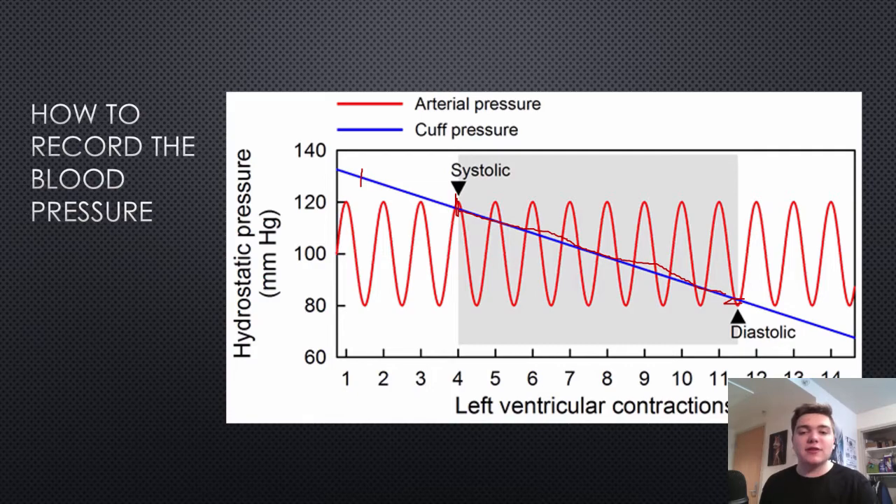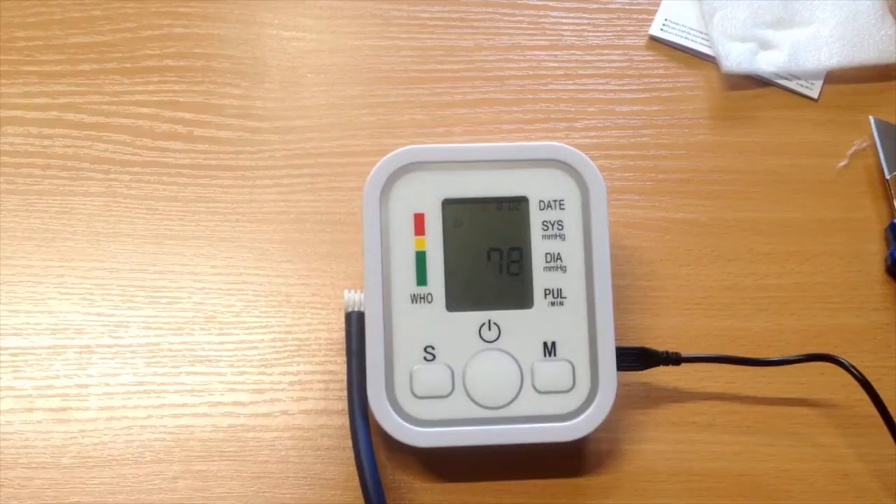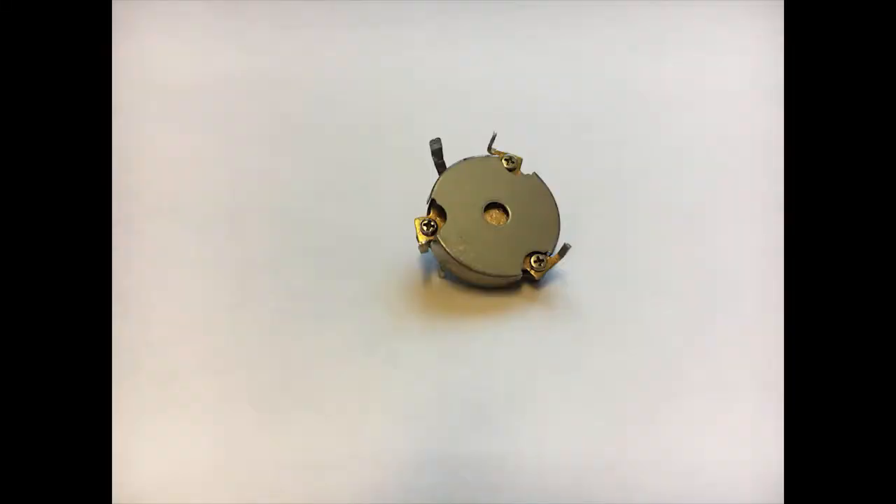After this, the pressure of the cuff is lower than the blood pressure, so there's no change in the sensor. The blood pressure monitor senses your blood pressure with a range of 5.3 kilopascals to 37.3 kilopascals. It also measures your pulse with a range of 40 to 199 times per minute. For our specific blood pressure monitor, an analog sensor was used to sense the pressure, specifically a capacitive pressure sensor.